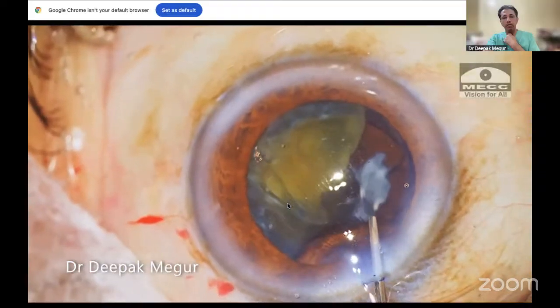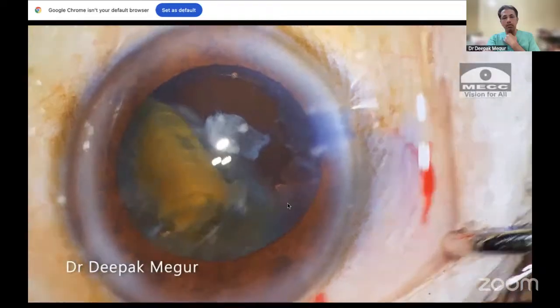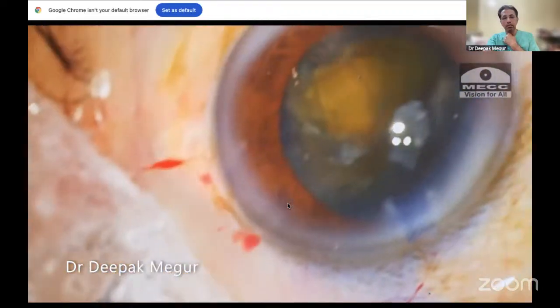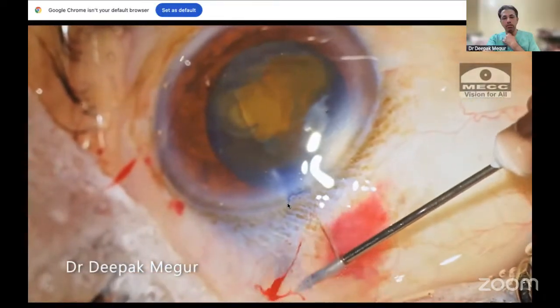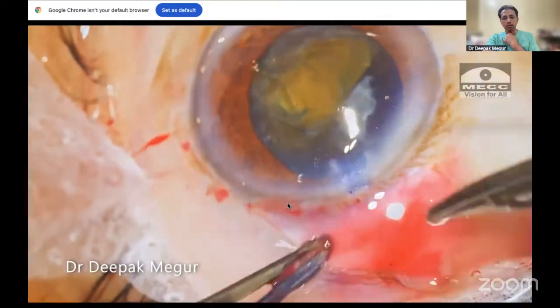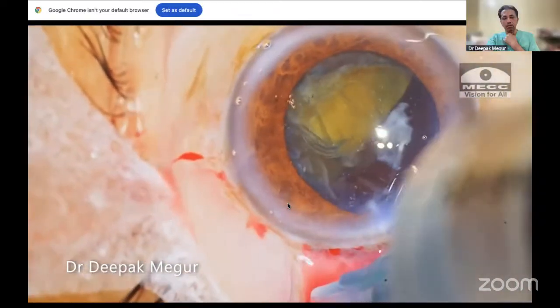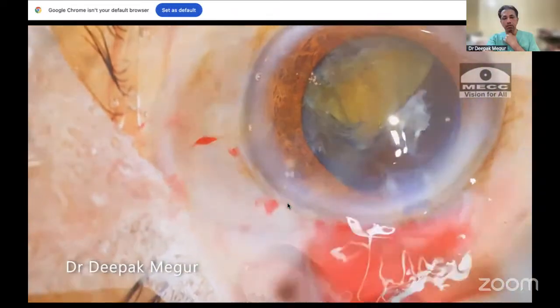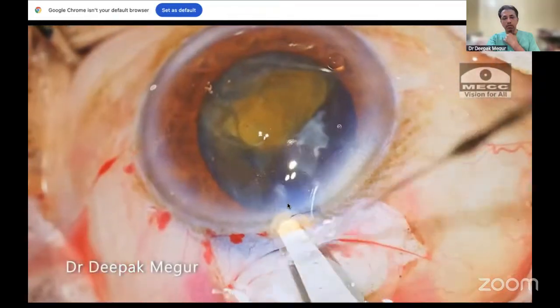Now, since the heminucleus is quite large and bulky, I decide to make a fresh scleral tunnel incision in the superior quadrant. Mind you, I was sitting temporally for the phacoemulsification. So I shift superiorly, give a subconjunctival lignocaine, raise a small bleb, then make a conjunctival flap, and then using a blunt cannula, inject 1 ml of lignocaine in the posterior sub-Tenon space. Augmenting anesthesia is critical, as I know that this surgery can take some time now.